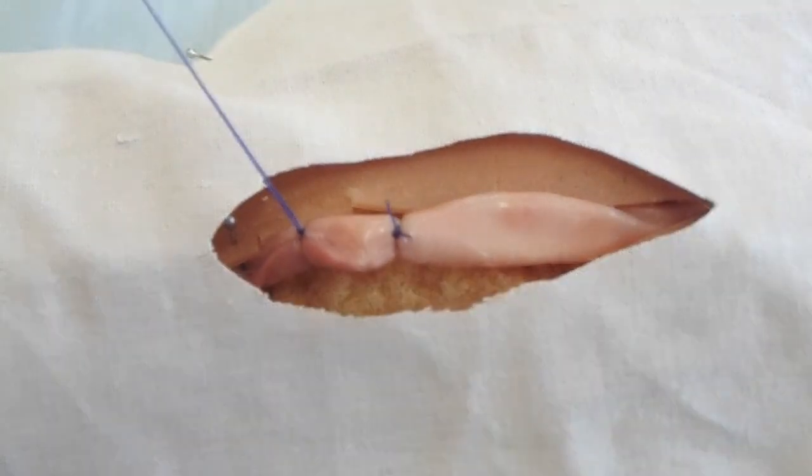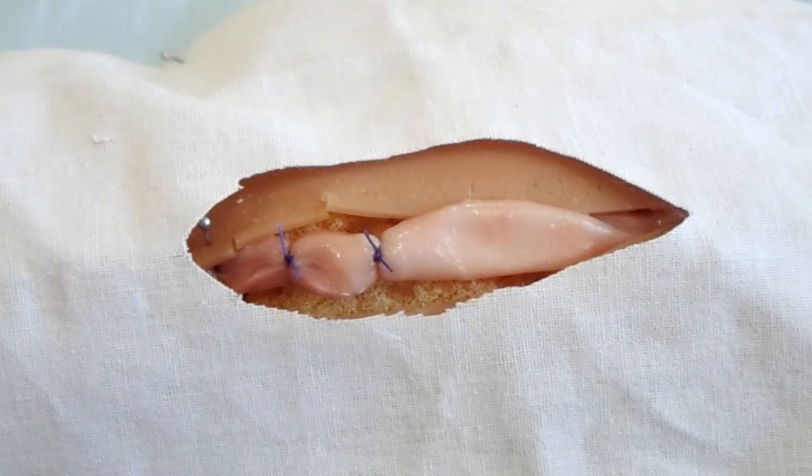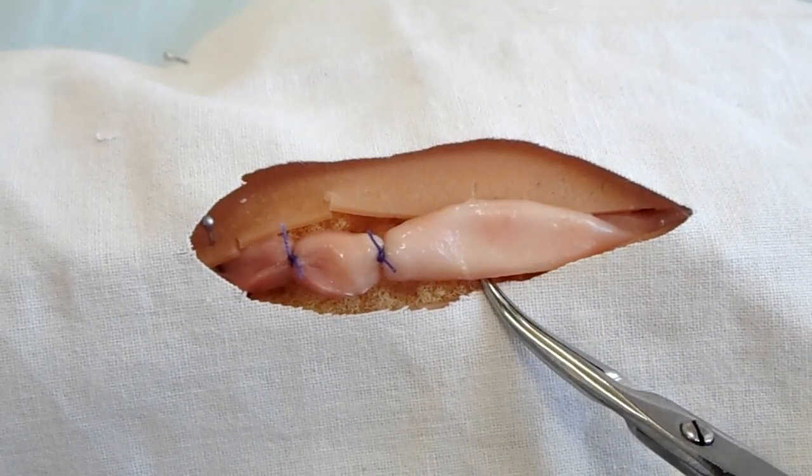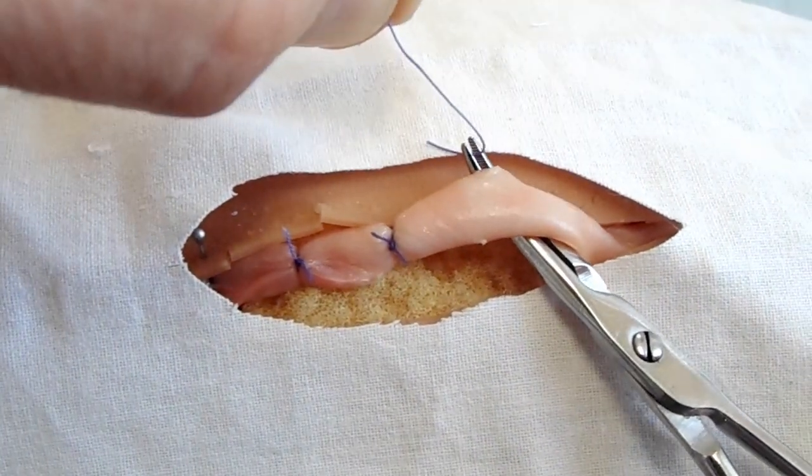The ends of the filaments are cut. In the distal part of the operative wound, a simple ligation of the vessel is also done.